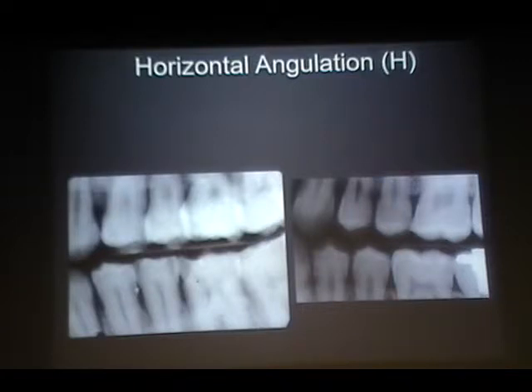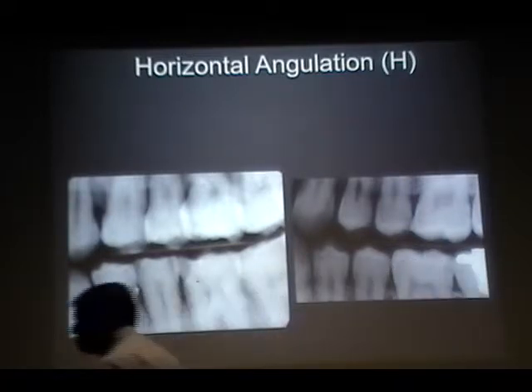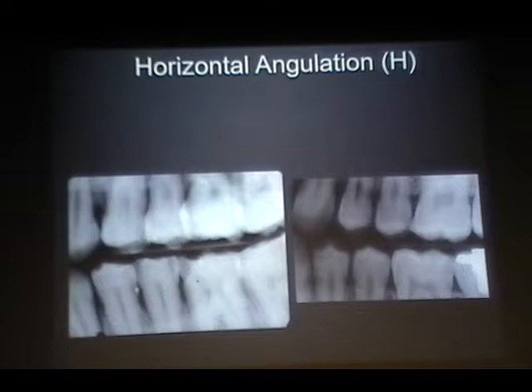I have a question. Yes. If you are doing the canine view, because you have the curves of the mouth, what are you doing it parallel to? Would you place the receptor parallel to the canine itself? Sometimes, okay, you have to look into the oral cavity. Sometimes you may have to place it straight on or parallel to the canine.